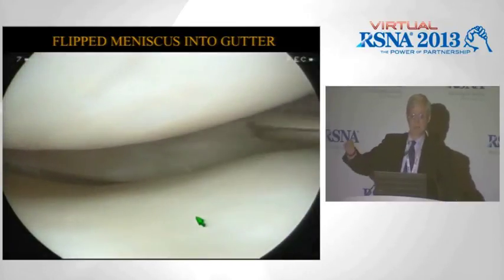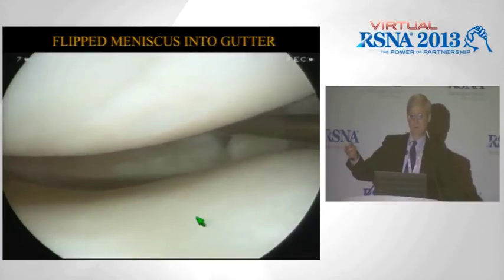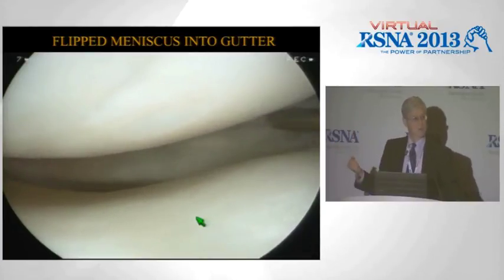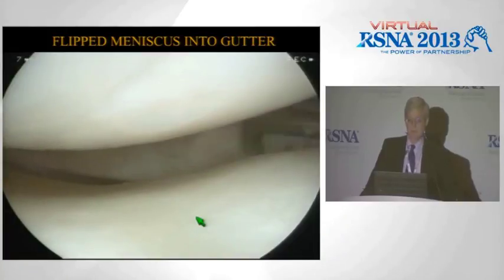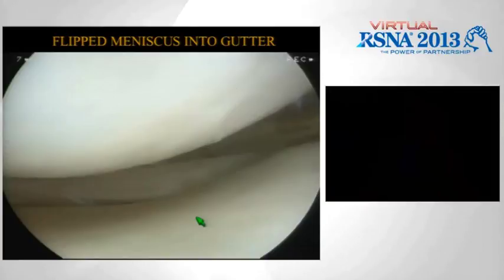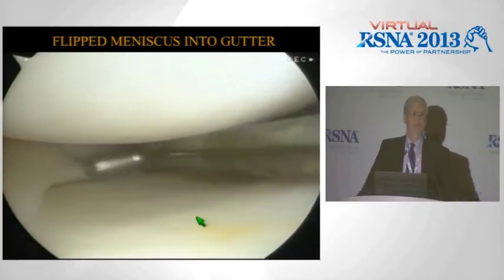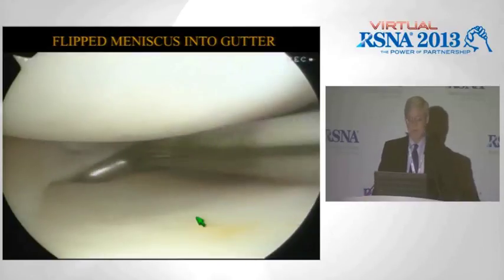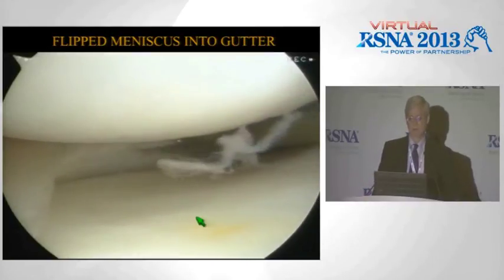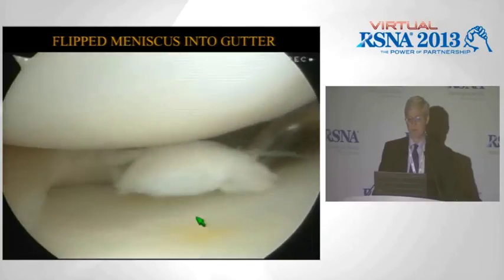You're going to see them actually probe this so they can flip back and forth sometimes. Notice how they're going to probe that, and they're going to be able to actually pull it out. That's what your arthroscopy colleagues are seeing. And then if it flips into that gutter, if they don't recognize that, the patient may wake up after their meniscal repair and not be better. And that's not a good situation for any of us, not our patients, not our clinical colleagues, and not us. And you can see them pulling it out as well.